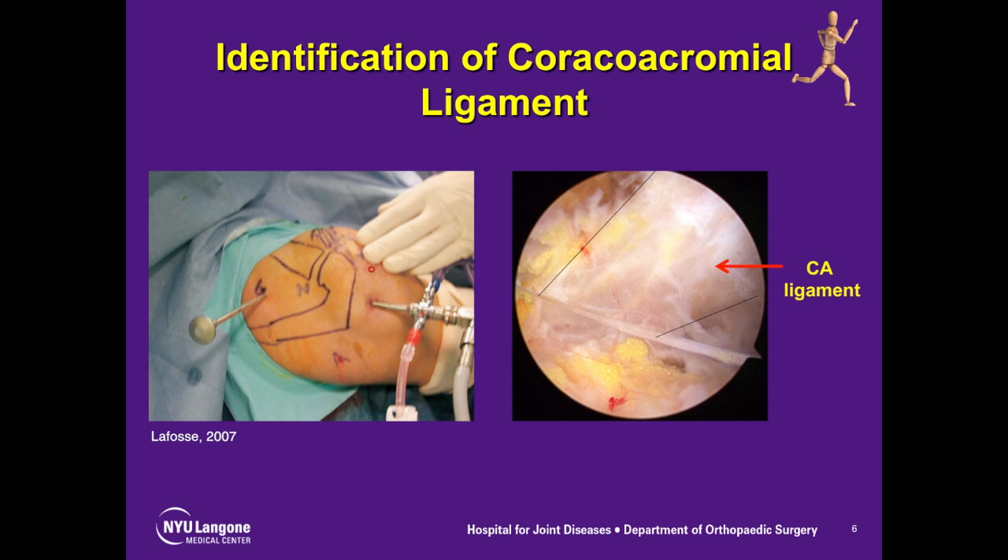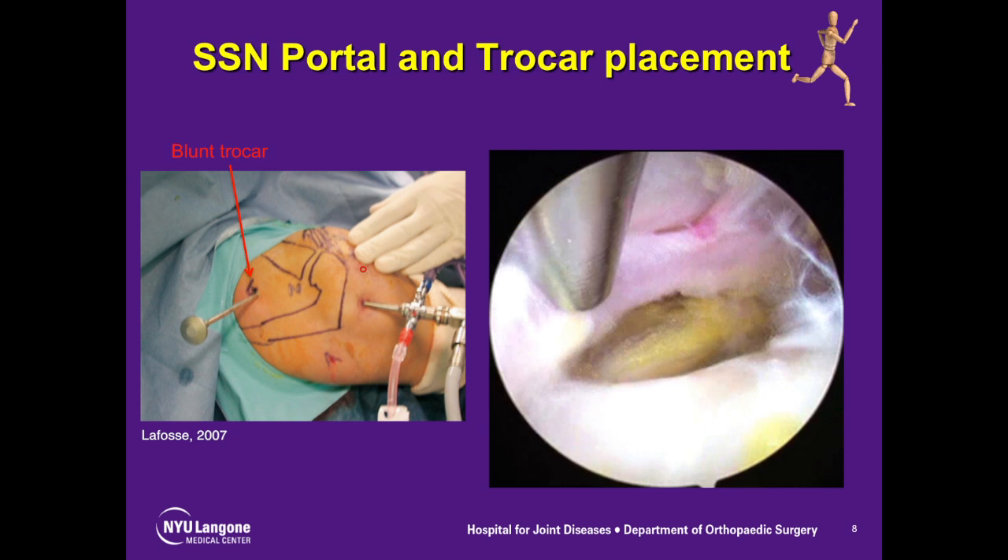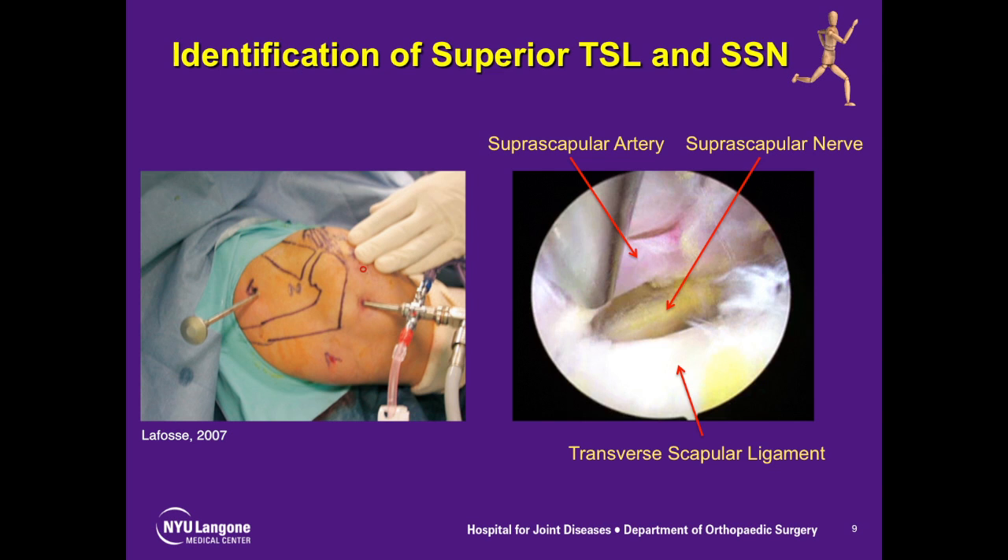Once the coracoacromial ligament is identified, it is then traced to the base of the coracoid. This is key — it can often be difficult when there's previous surgery, but it's usually always there. This will then lead you to identify the coracoclavicular ligaments, and once identified, that leads you to the base of the coracoid. Once the base of the coracoid is identified, we place a trocar in the suprascapular nerve portal. This will allow dissection to help us find the suprascapular nerve and the transverse scapular ligament.